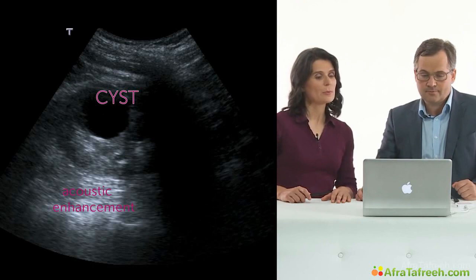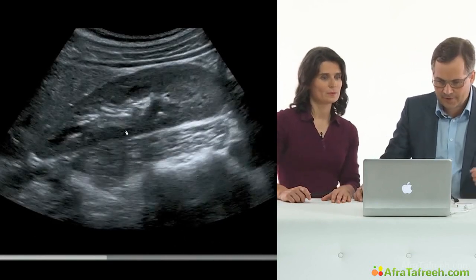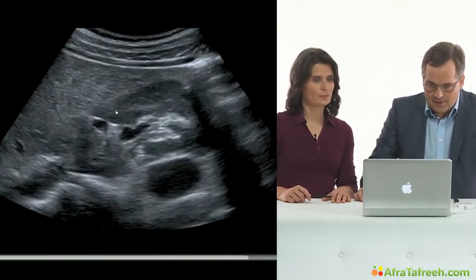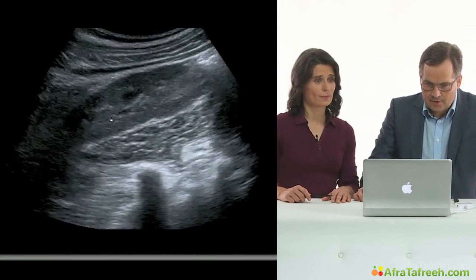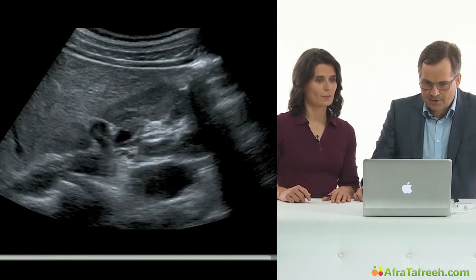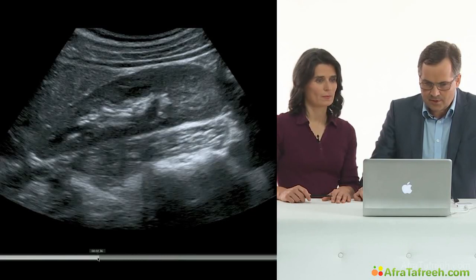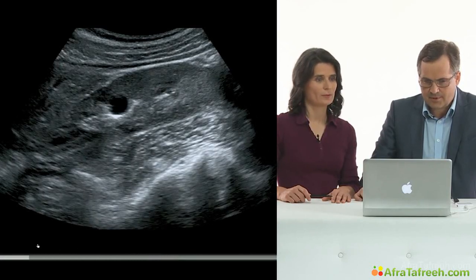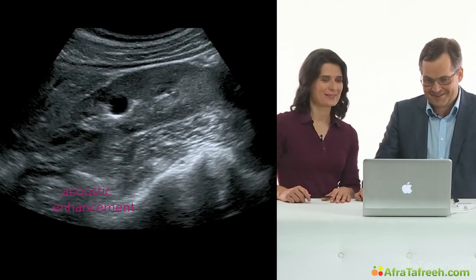We got a video clip of a cyst too. You can lovely see this round black structure over here, and this acoustic enhancement posterior to it. I'll stop the clip. Over here. Now it's really looking like a flashlight, isn't it? You're right, it's a flashlight.